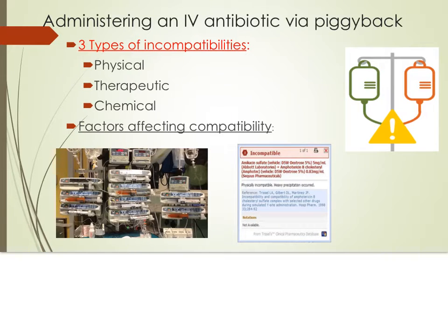When administering any medications, including antibiotics and fluids, the nurse must always check for compatibility prior to administration. Different fluids can be incompatible with each other, and medications can be incompatible with not only other medications, but also with certain fluids. Always check the antibiotic you're about to administer is compatible with fluids already in the line. Also check to make sure that the antibiotic is compatible with any other antibiotics that may have been run through the same secondary line.